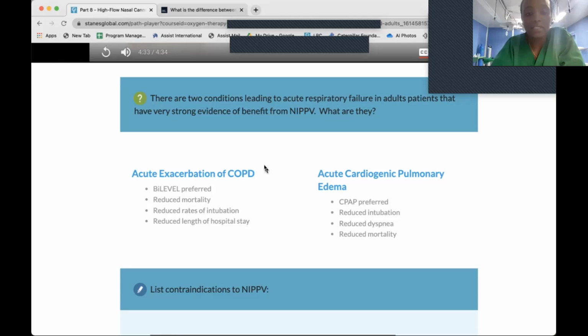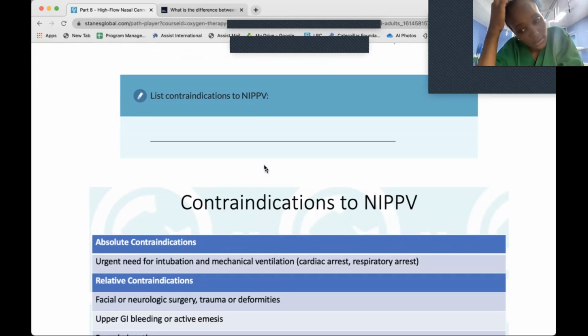These non-invasive pressure ventilation modes are also very good and important. It's important to note that they need to be performed in a patient who is responsive and who will understand what you're going to do so that they don't keep fighting the ventilator. As they fight the ventilator, this will affect the mode of treatment. So the patient needs to be cooperative and needs to be spontaneously breathing. Can go down, Sarah. The contraindications.